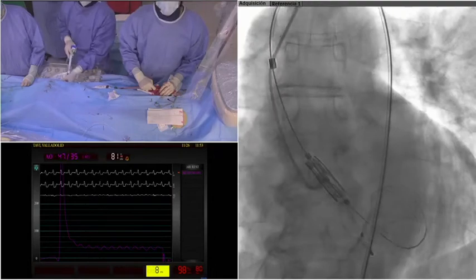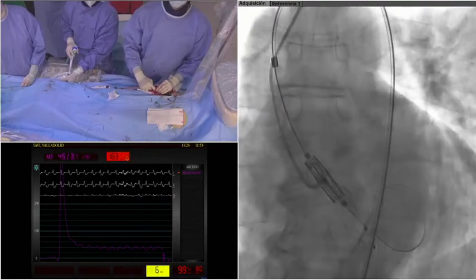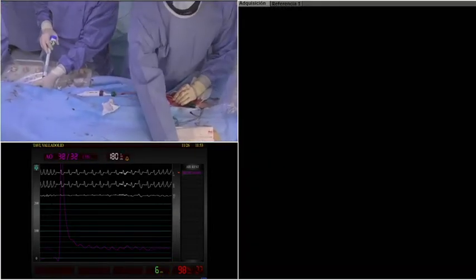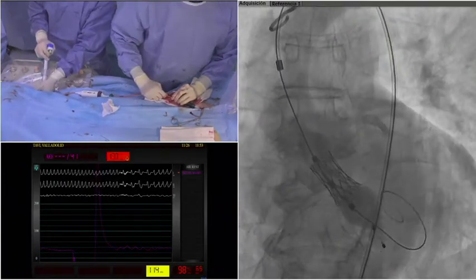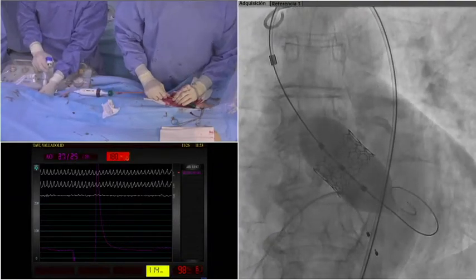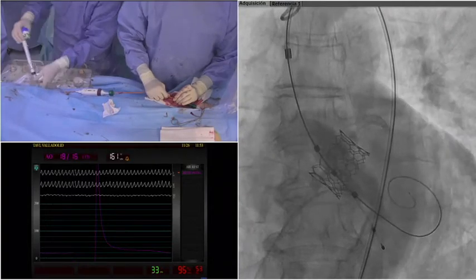Pacemaker yes. On. Let's go, now, Mario. Up, inject. Going. Up, come on, all the way up. Okay, I'm correcting a little bit the position. All the way. Balloon down. Pacemaker at 40. Okay.